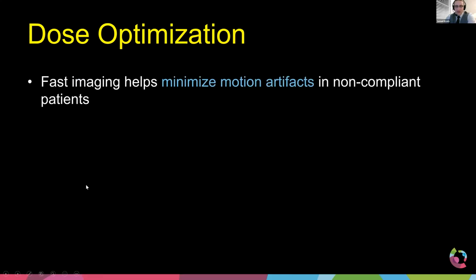But that's why we set several protocols, 5 of them up, so that we can actually image several of them at 100 kV for the little kids, and then a couple and the rest at 120.